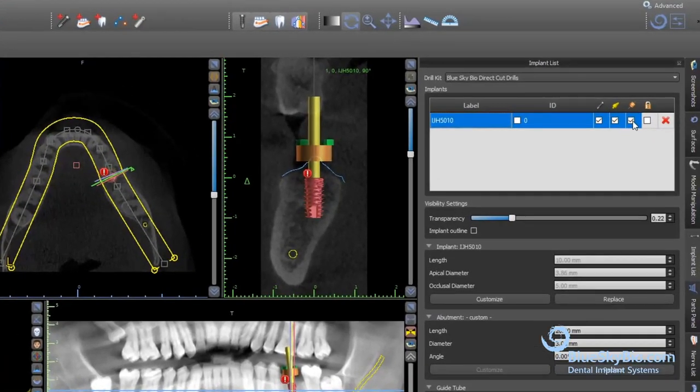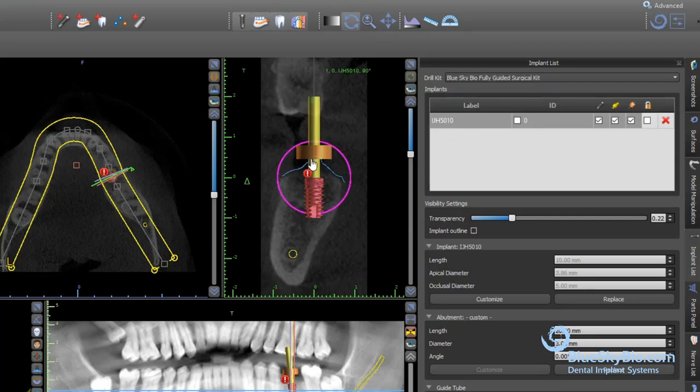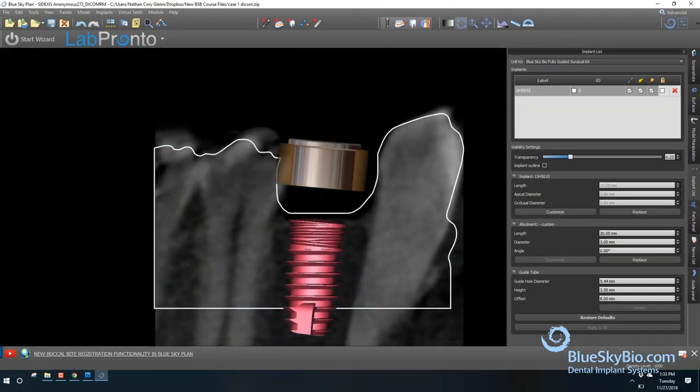In the drop-down menu at the top of the implant list, choose the fully guided keyless kit. This will automatically set all the surgical guide tubes to the ideal position. The printed hole in the surgical guide, represented by the brown software guide tube, houses the metal cylinder. The hole has the correct inner diameter and is automatically positioned to guide the drill to the correct position and stop it at the correct depth.